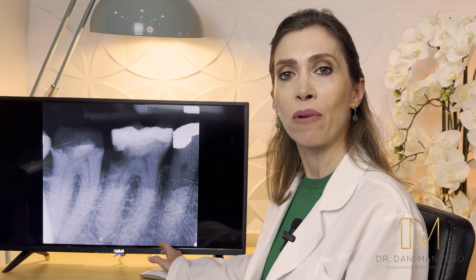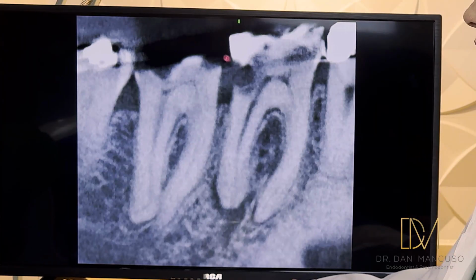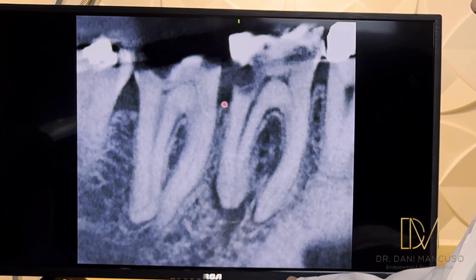So this x-ray was referred to us. The first thing we do, although the CBCT was not advised for deep caries, is that you can see the deep caries in there. And yes, it is subgingival, quite deeply subgingival, but look at the bone level. The bone level is not too bad compared to where the margin of the tooth may be.